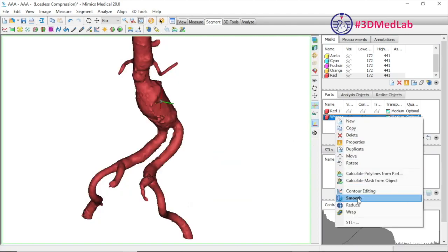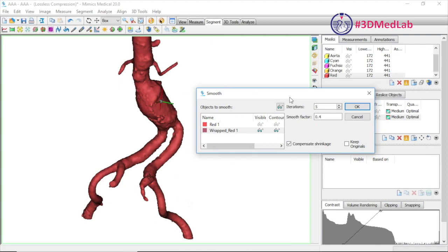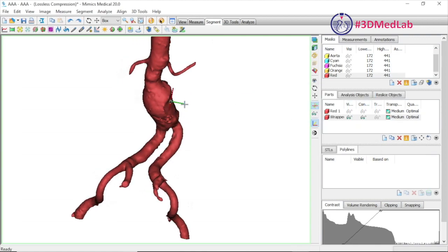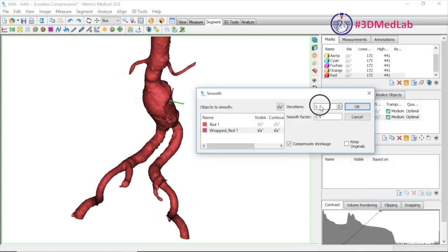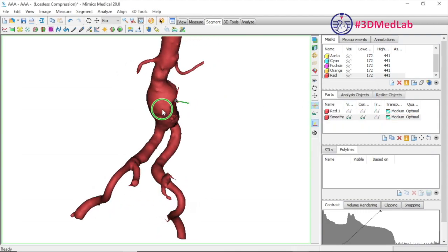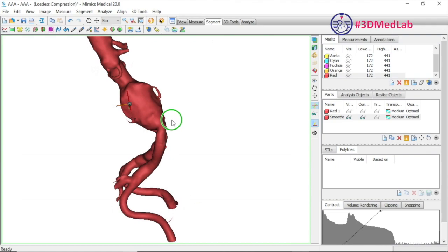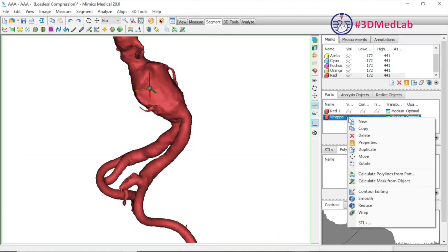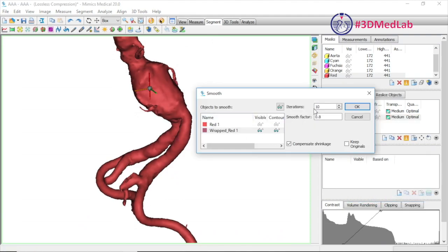You can make the model smoother using the smooth function and adjust the settings to make it more or less smooth as desired. The only thing to keep in mind is that if you make it too smooth, some branches will become very small and essentially unprintable. You probably don't want to overdo it, so I'm going to go back to the suggested settings.